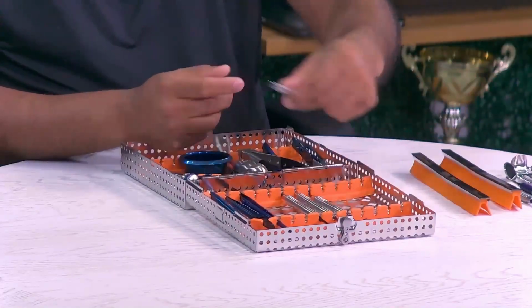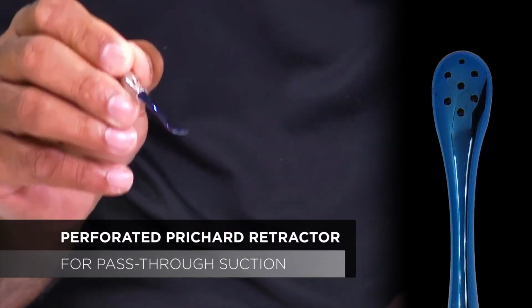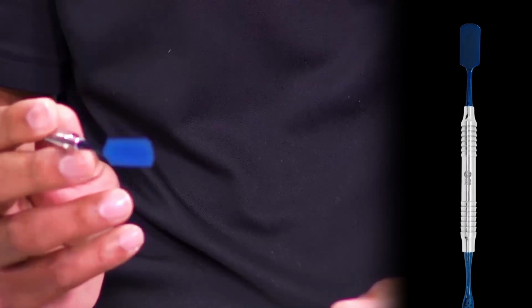The second instrument for flap is a larger periosteal that has hollow holes in it. Sometimes we use it to pack bone so that we can get seepage through it. But also, as we're laying bigger flaps, we're using this to dissect larger areas. And on the end of it, we have this paddle, which I like to use to hold back my larger flaps. So again, very purposefully designed to do some reflection and also flap retraction. The combination of the two allows me and my assistant to both reflect flaps when we're working in a critical area and we need good visualization. So that's why we have both of these instruments.